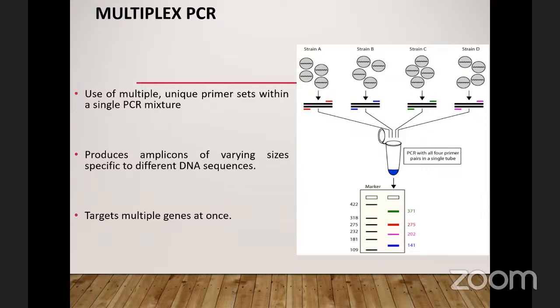So we can set up PCR and say, okay, let's just diagnose if there's malaria parasite present, or let's check if there's Lassa virus present in this sample. But in multiplex PCR, we're actually looking at various targets. So even for the Lassa virus, we are going to be checking for different genes in the virus. You are not just looking at one gene, but in the same setup.